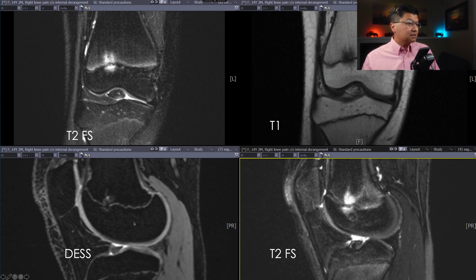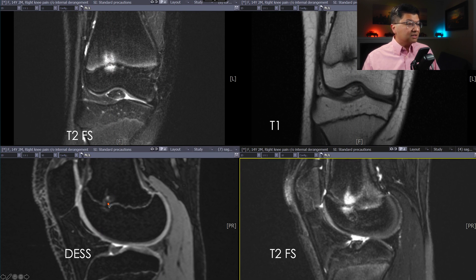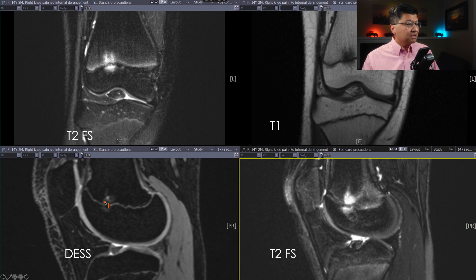And on this dual-echo-steady state, we see the nice, bright physis quite well, except here we have a little tethering. We have bone from the metaphysis coming in to attach to bone from the epiphysis, with some surrounding edema.